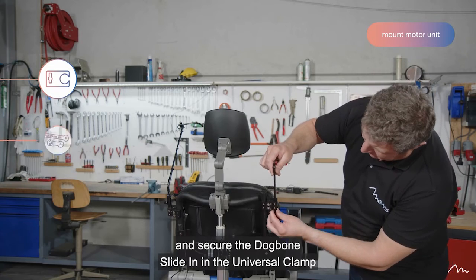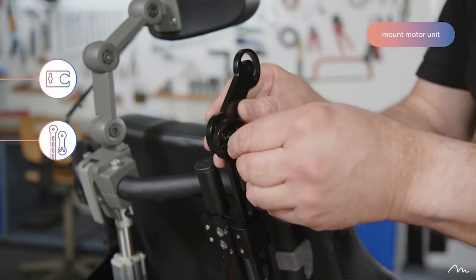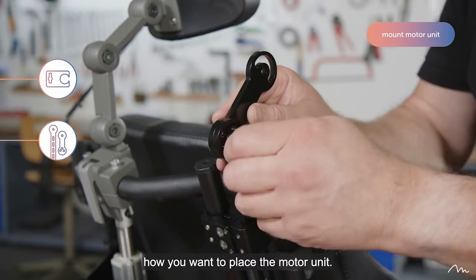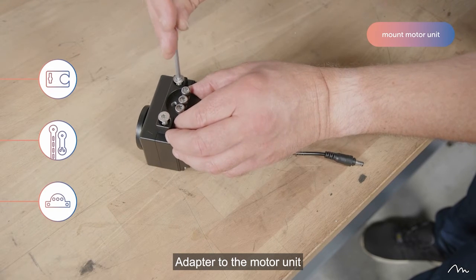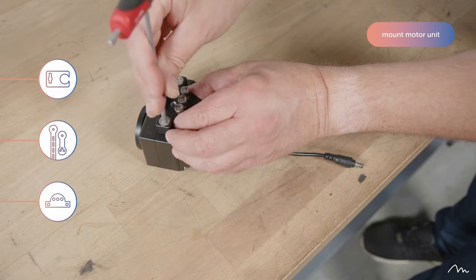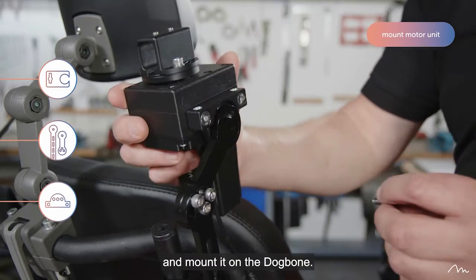Next, place and secure the dog bone slide-in in the universal clamp and the dog bone extension onto the dog bone slide-in, depending on how you want to place the motor unit. Then, attach the dog bone adapter to the motor unit and mount it on the dog bone.